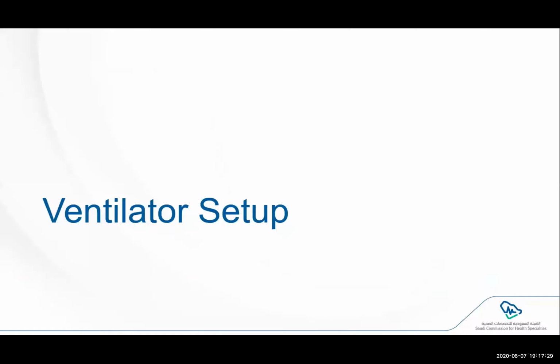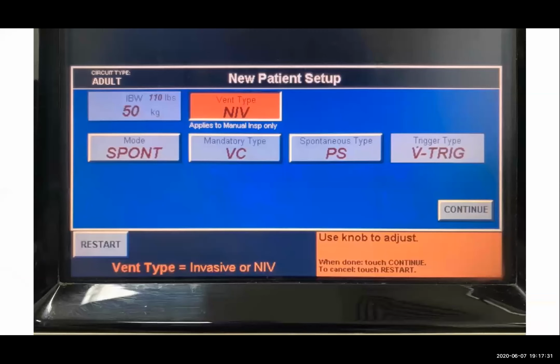In this demonstration, I chose the Puritan Bennett 840. I believe this is the most common ventilator around. I know there are other machines, but this could be the easier one for the presentation. In your ventilator, you have to choose the non-invasive ventilation. I hope your ventilator does provide this. If some ventilators don't provide non-invasive ventilation, you might have some problem with the compensation of the leak and the ventilator will not stop alarming.